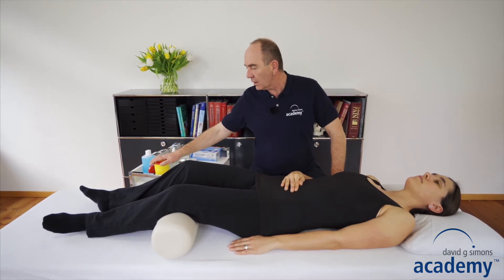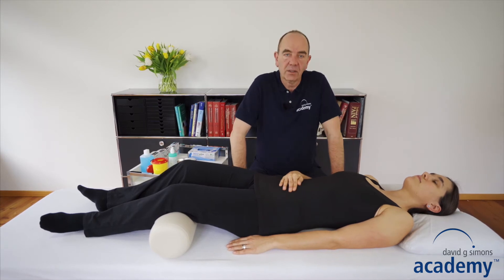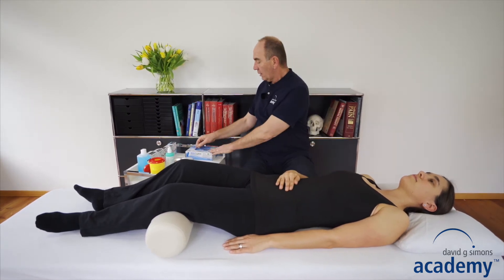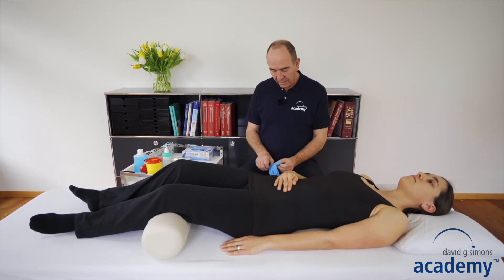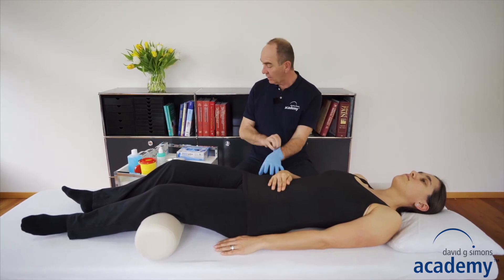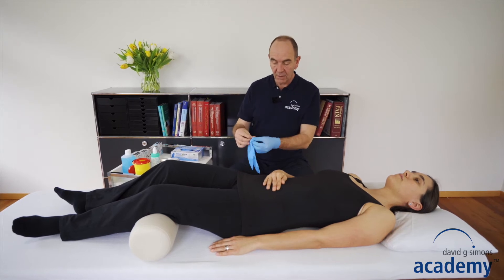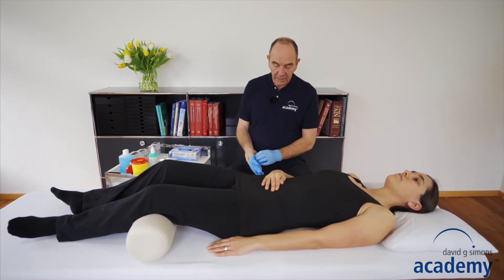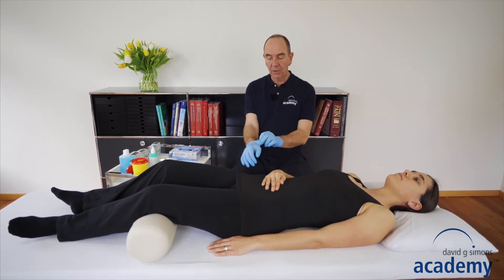Be sure that the needle collector is open — that's a good way to prevent accidental needle sticks. Then take the gloves. The gloves are basically for your own protection, so we use gloves on both hands. It's just in case you have to repalpate the muscle and in case of a bleeding, because of course you don't want to touch blood with your hand.